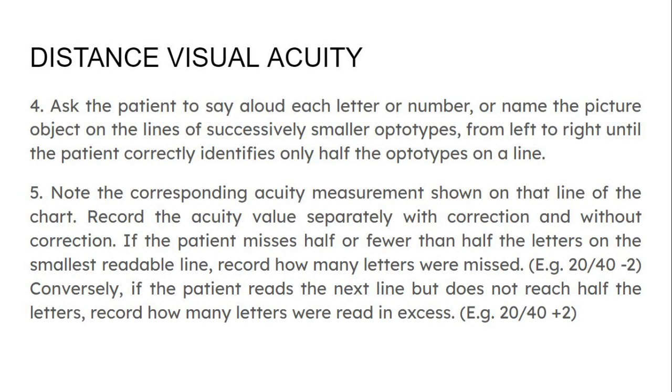If the patient misses half or fewer than half the letters on the smallest readable line, record how many letters were missed. Conversely, if the patient reads the next line but does not reach half the letters, record how many letters were read in excess.